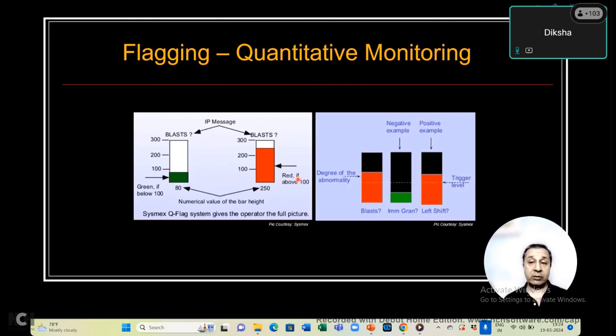What is also important to realize is that while the percentage may not be exact or truthful, you also need to remember that you will be able to quantify in certain cases. So depending upon the thresholds that you're setting up, the relative quantifications can also be given by the analyzer, which obviously will not be 100% foolproof, but at the same time will alert you to what kind of abnormality you're dealing with.